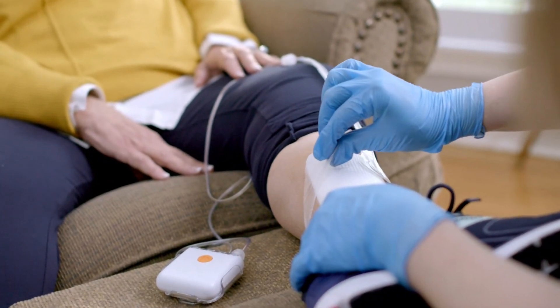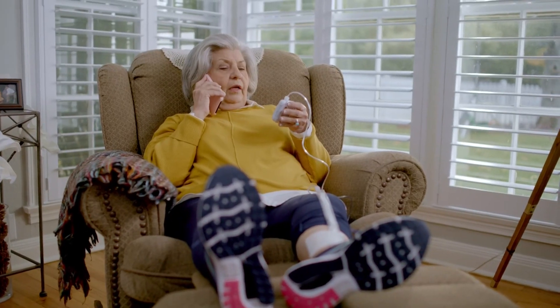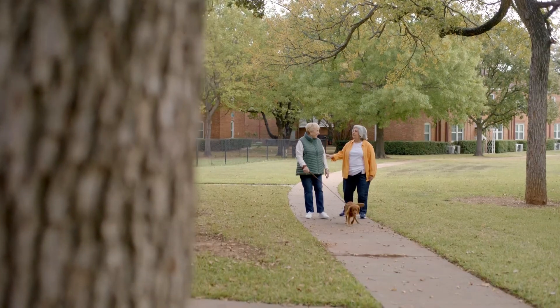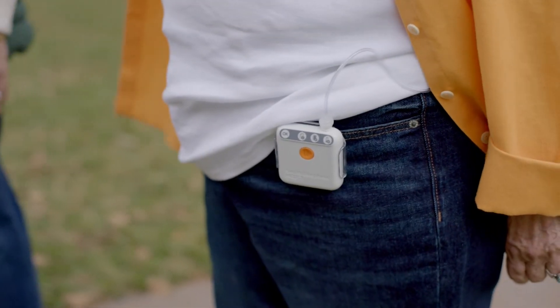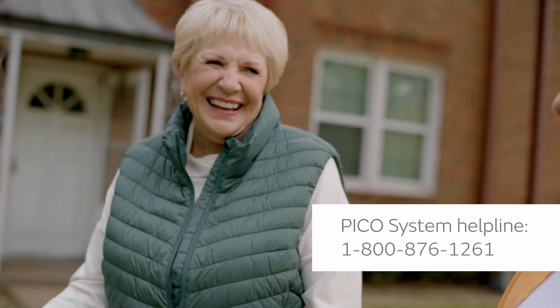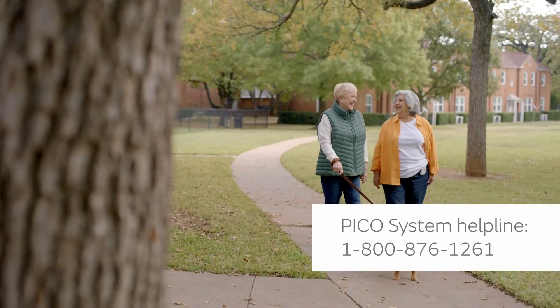Your dressing may be changed or removed in your health care provider's office, by a home health nurse, or as directed by your health care provider. If you have any questions about the PICO system device that haven't been addressed in this video, please call our helpline at 1-800-876-1261 to speak to a registered nurse.